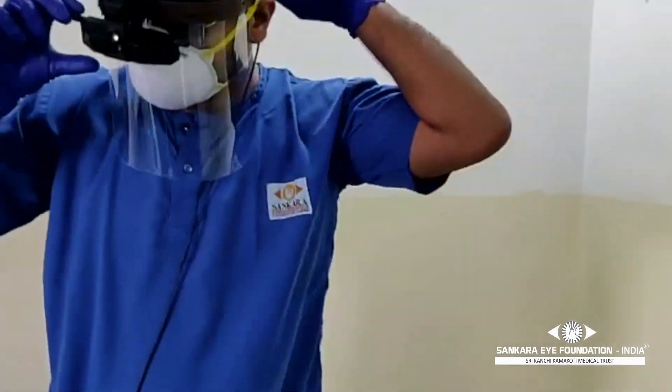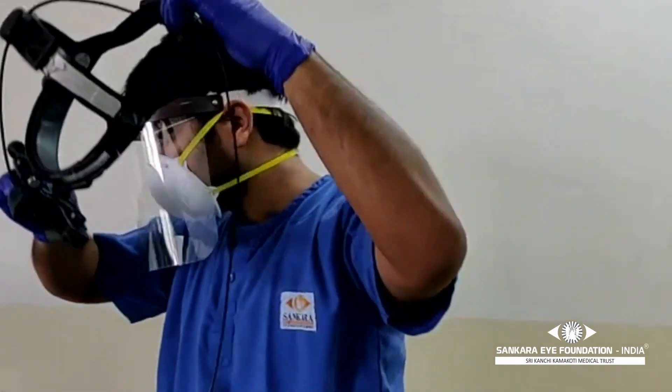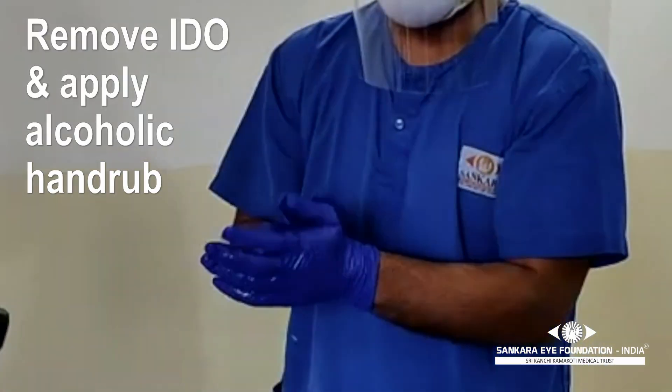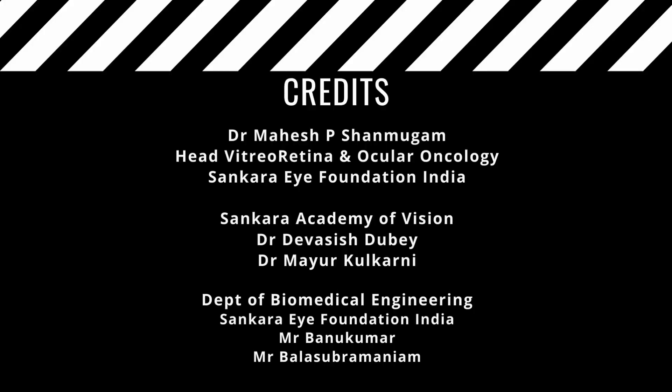After removing the indirect ophthalmoscope, re-sanitize your hands before proceeding with further examination or documentation. We hope you found the video to be informative and helpful. Thank you.